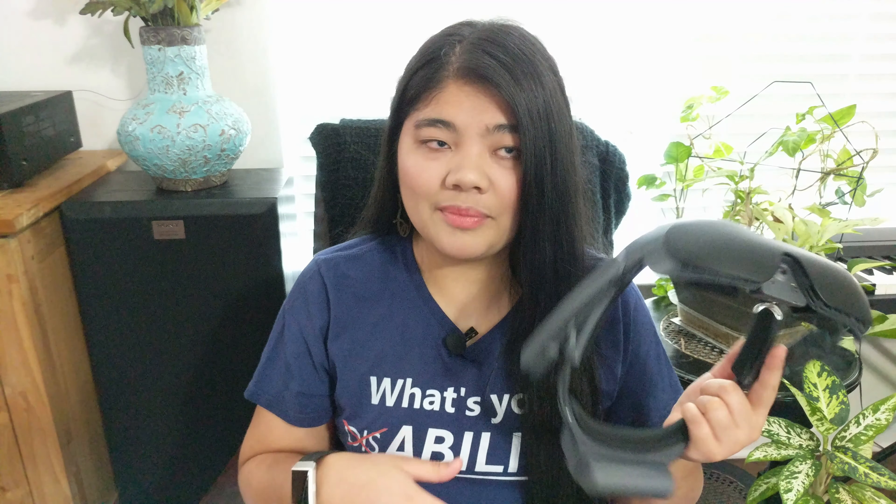You can also change the batteries while you are using the eSight 4 — it's called a hot swap. You just take off the battery and pop a new one in, and it doesn't turn off the device, because the eSight 4 has a built-in battery that lasts 5 to 15 minutes, giving you time to swap it out. That's a really great feature when you're using it continuously.